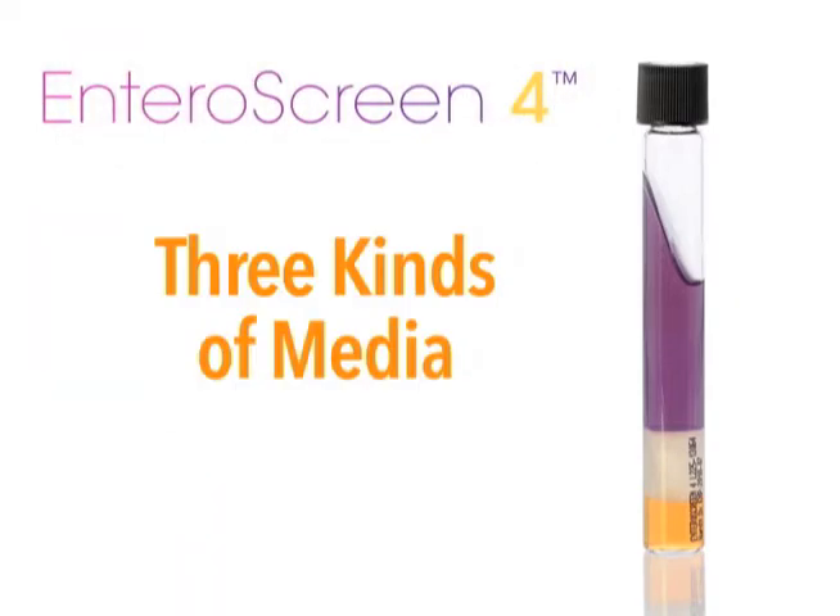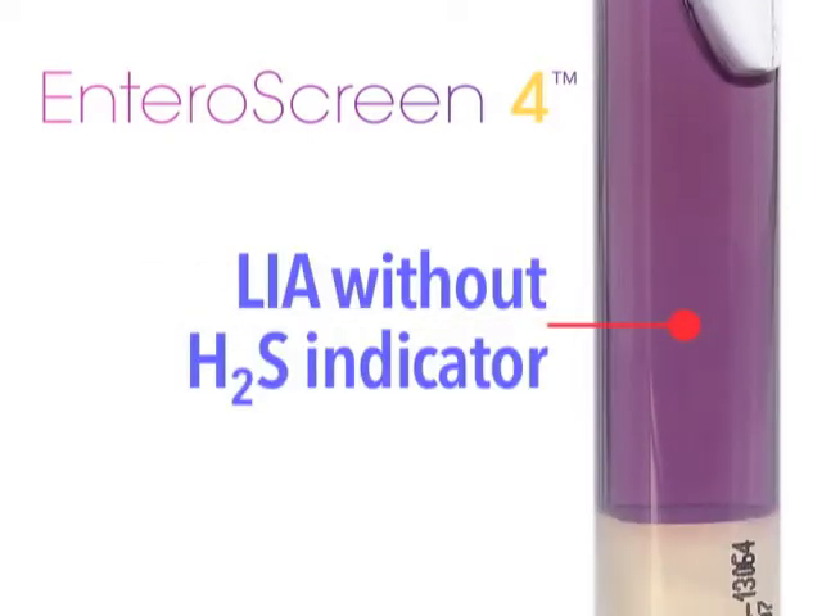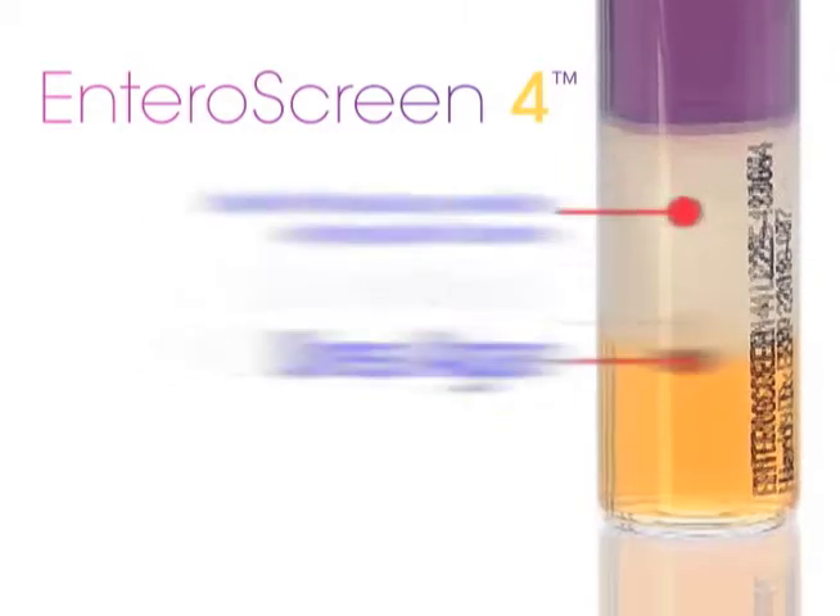Enteroscreen 4 consists of three kinds of media: lysine iron agar with an H2S indicator, lysine iron agar without an H2S indicator, and urea agar.